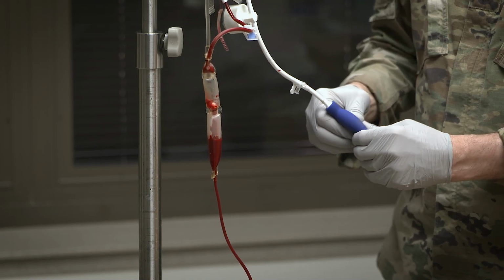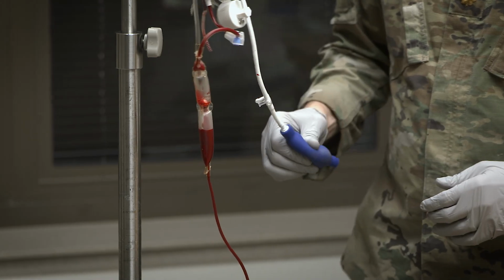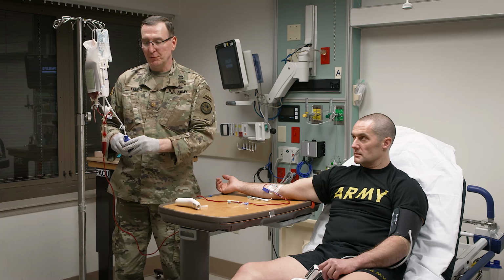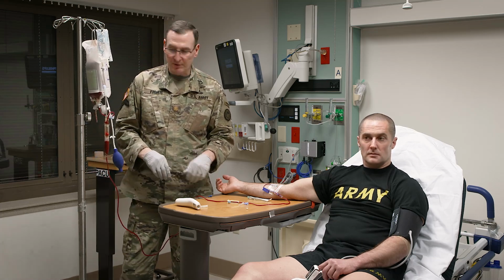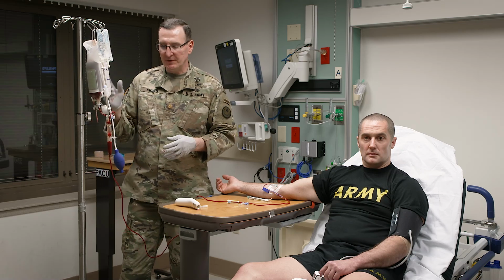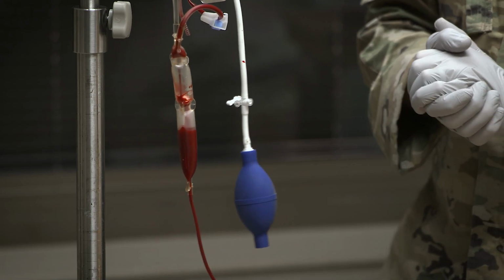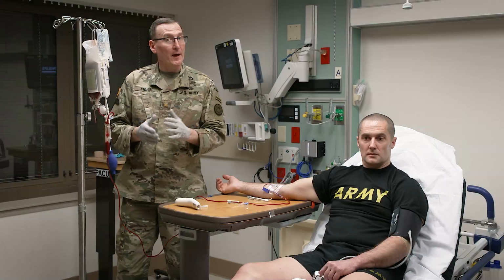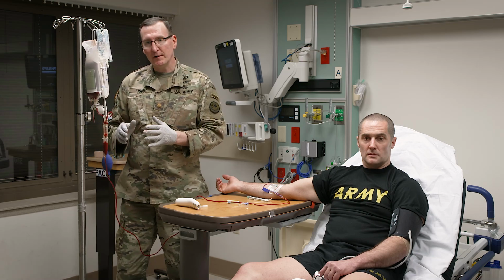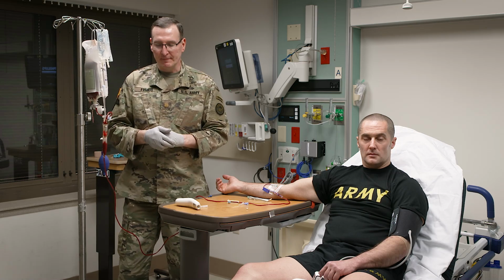Now be mindful that if you are going to be transfusing blood to casualties, you may have to use multiple different units of blood to treat your patient. Just make sure that you're aware of that. If you're using one type of blood, then it should be safe to continue using the same set. If you end up switching blood types, say if you start off with a low titer unit and then you switch to an A, or you start off with an A and you switch to a low titer, you may consider flushing that line appropriately with your normal saline.